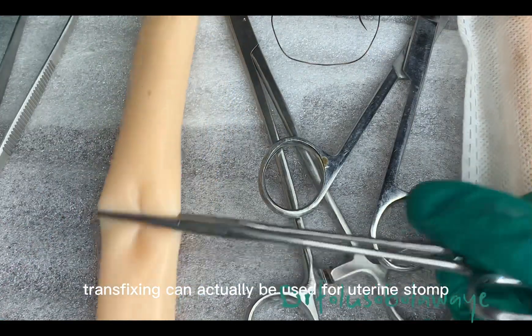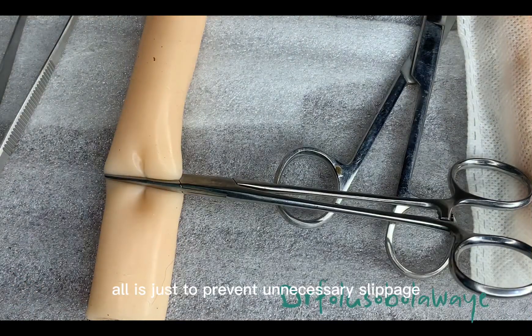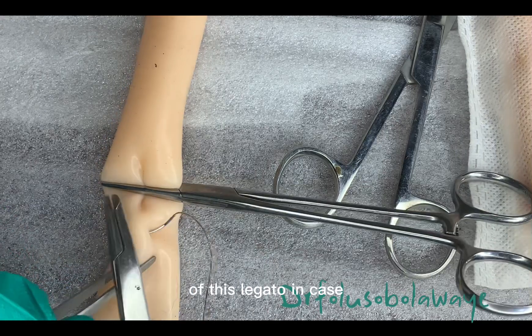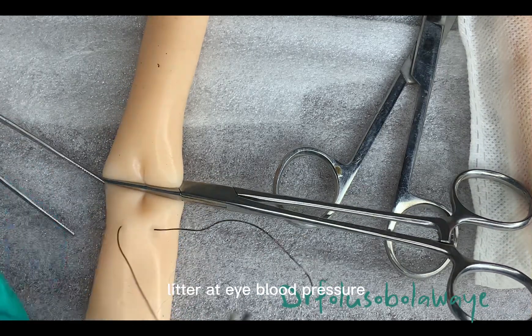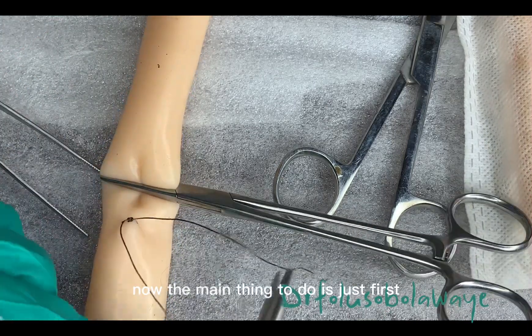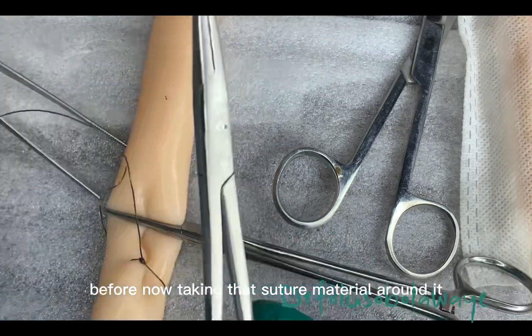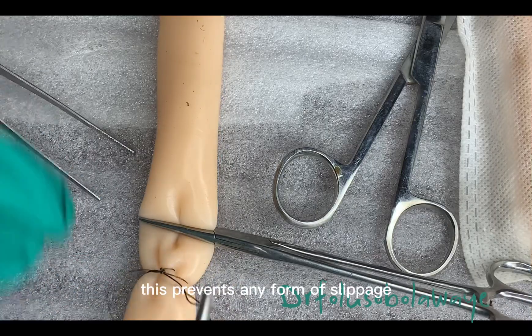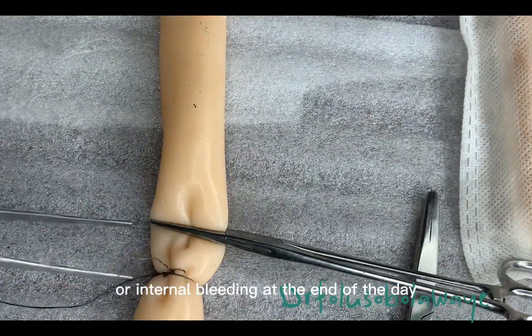Transfixing can actually be used for uterine stump or even the ureter. All is just to prevent unnecessary slippage of this ligature in case blood is pumped through this particular hollow organ later at high blood pressure. Now the main thing to do is just to first take a bite through this particular hollow organ before taking that suture material around it. This prevents any form of slippage or internal bleeding at the end of the day.